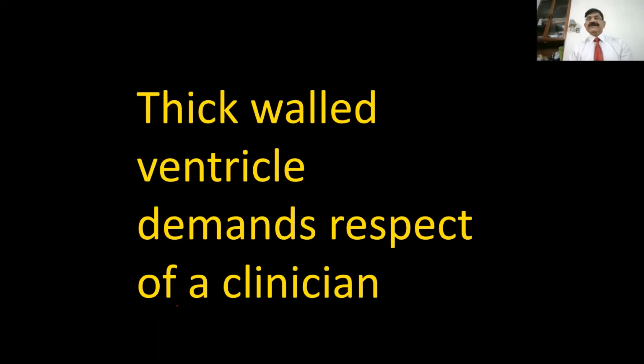So, ladies and gentlemen, let me summarize by saying thick-walled ventricle demands respect of a clinician. You should be able to provide clues to the differential diagnosis by doing a good echo and tell the clinician what he or she should be doing next, whether genotype should be done, alpha-galactosidase A level should be checked. CMR, of course, is required in most of these individuals, it helps in differentiation.